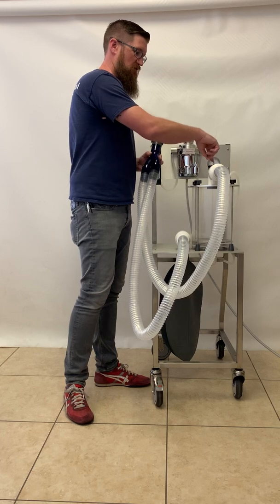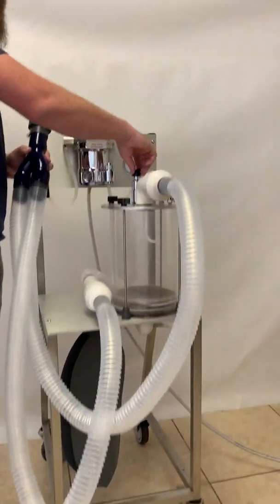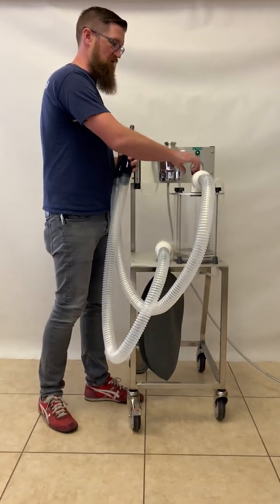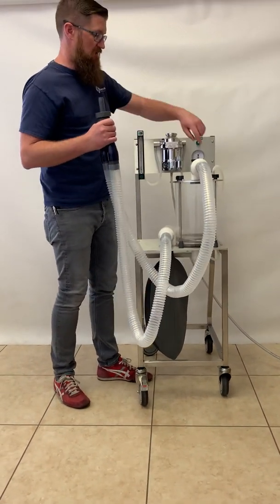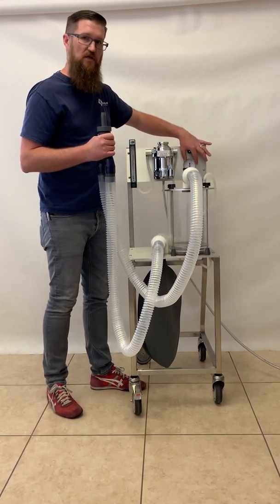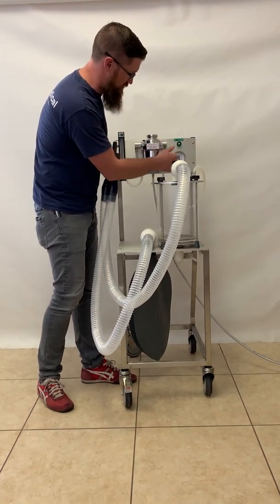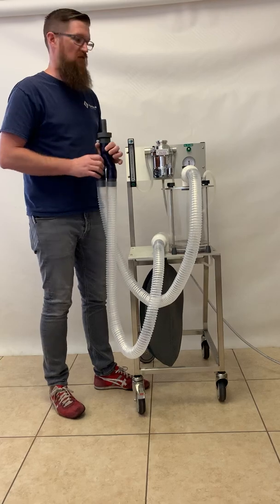The circle system also includes an adjustable pop-off valve that you use to adjust the pressure in the system. This generally would be left open or mostly open unless you're using it with a ventilator. So generally this will operate in the open position, or mostly open if you'd like to generate a little back pressure. The tube connected to the top of the absorber goes to the pressure gauge, which monitors your circuit pressure or airway pressure of the patient. Most of the time you want to remain between 0 and 20 centimeters of water pressure on that gauge.